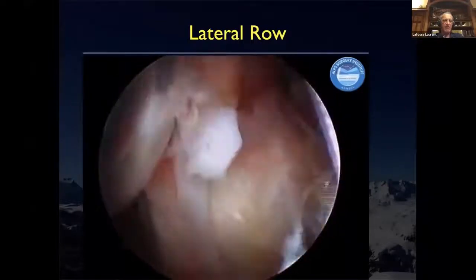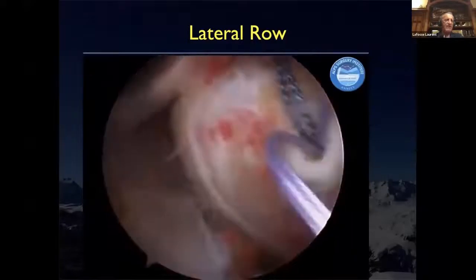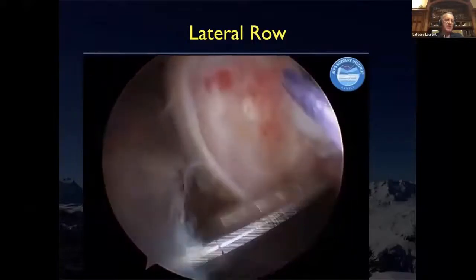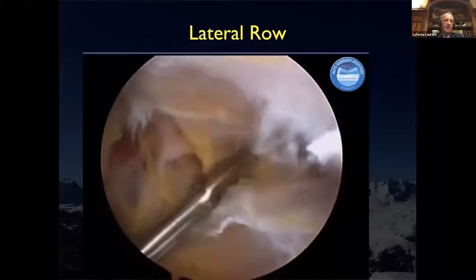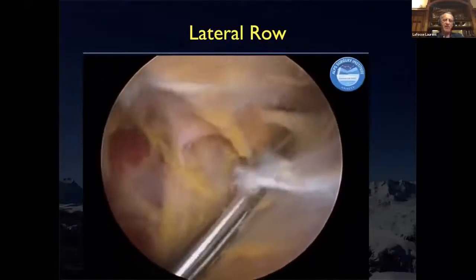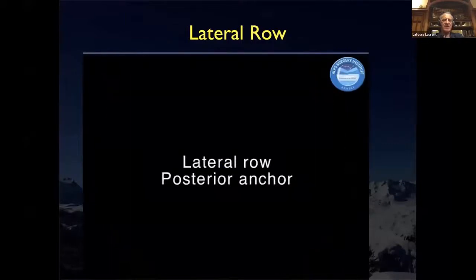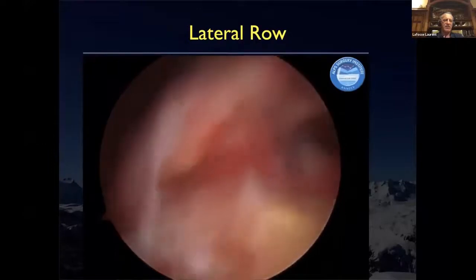And in order to have room between the biceps, between the deltoid and the infraspinatus, I just insert the Foley catheter that urologists are using. And if you dissect the nerve, which is the axillary nerve laterally here, you can see that this is where you see the nerve, and it's not dangerous for the nerve.